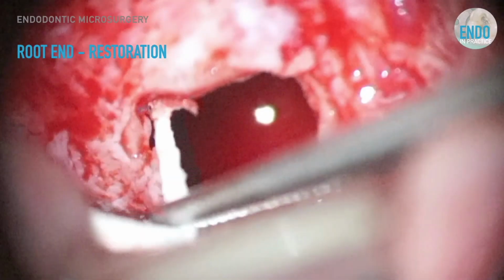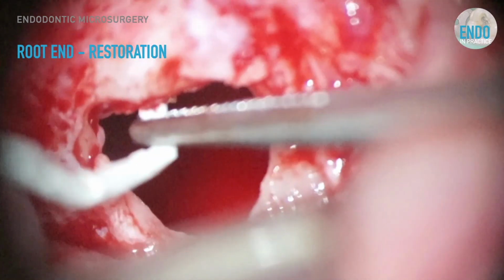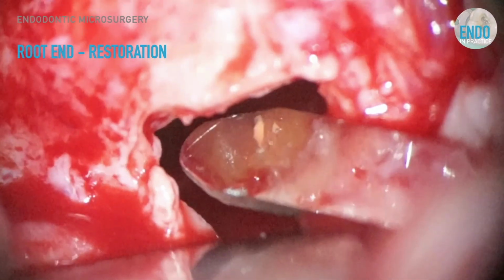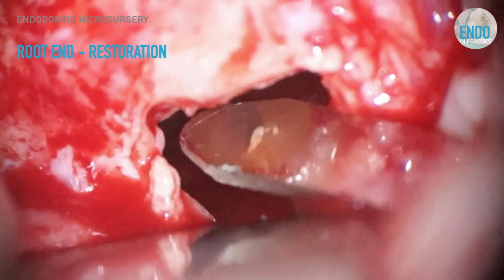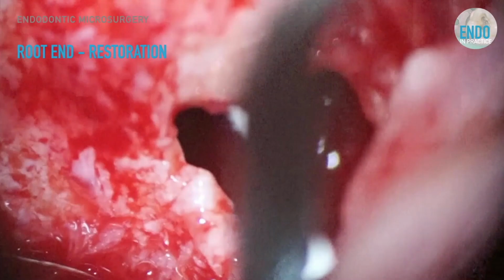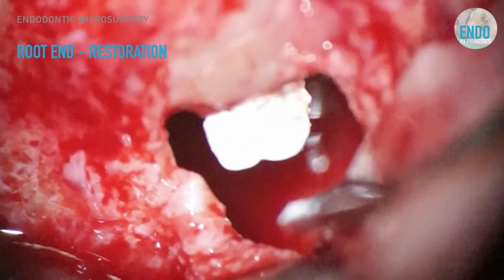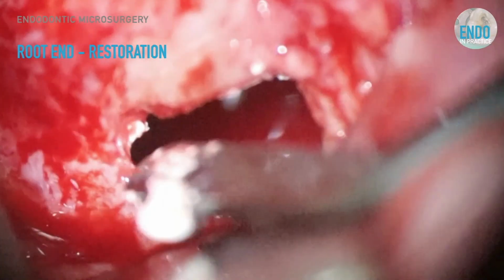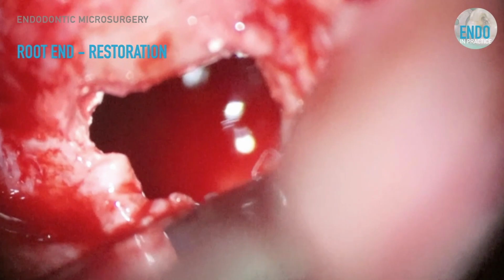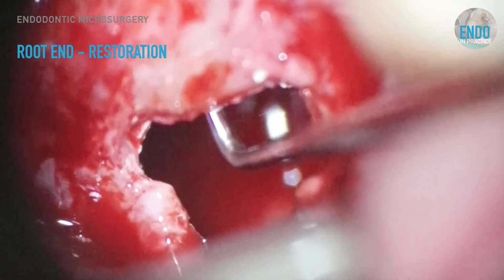The putty, as you'll see, is a lot easier. This is the first time I actually ever used putty, and I probably used enough for about 5 cases. But you can see the retrograde preparation. Nice resection on the GP. This, and I think it's MTA, and the amount I've got on the actual flat plastic. So a reasonable amount of it went to waste there. But you can see how it's a lot cleaner. You don't get the spillage. It's a lot easier to handle.